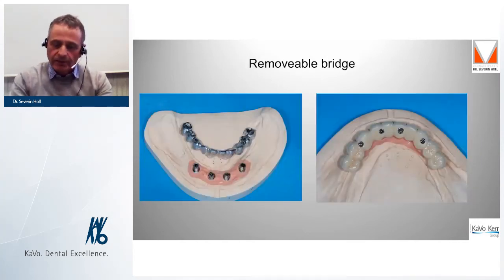But again, the opinion of the patient has changed in the healing period. Suddenly, it should be a fixed bridge. Of course, we make everything possible. Thus, we decided to provide the patient with a shortened bridge, removable by screwing connection. On the left side, you see the CAD/CAM milled bridge framework, and on the right side, the ceramic finished bridge.